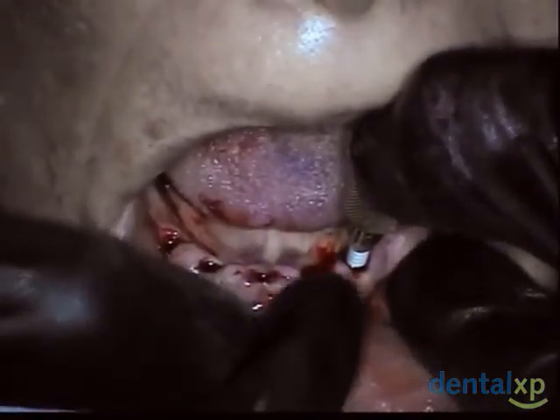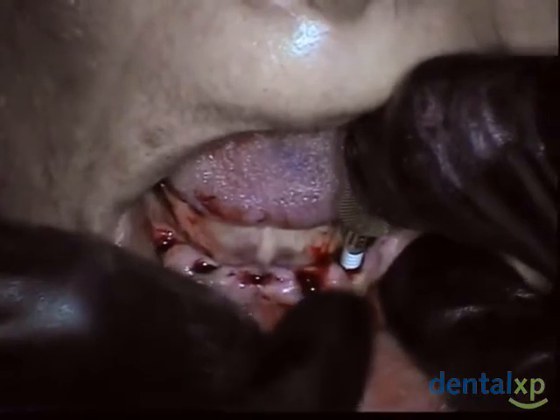And this is a very aggressive thread design, so why am I telling you that? With a lot of force, you could actually create a new osteotomy. Now, I'm not strong enough to do that, but I have 2 assistants that could easily do that. So therefore, you want to make sure that you're not going in an area that wasn't prepared. In this type of bone, I should feel that it's starting to engage, because at this point, we're still driving a 3.25 implant into a 2.5 or 2.4 hole. And if we use the tap, it's going to be the same diameter as this implant. It just creates the thread so that it may be easier to place.